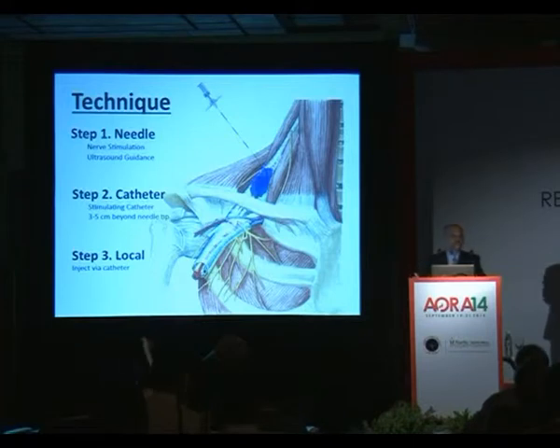That's an important distinction between the other technique, where you inject your local anesthetic through the needle and then blindly thread your catheter. With the stimulating catheter technique, you inject your local anesthetic through the catheter itself to induce the block.